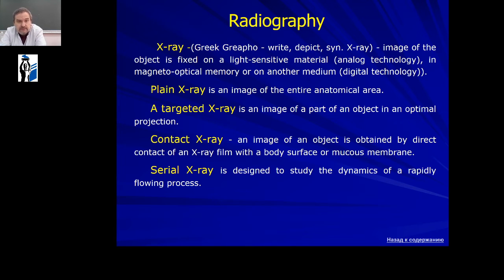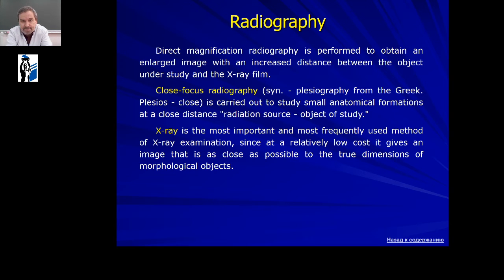Serial X-ray is designed to study the dynamics of a rapidly flowing process. Direct magnification radiography is performed to obtain an enlarged image with an increased distance between the object under study and the X-ray film.